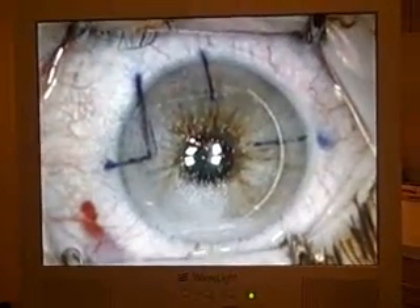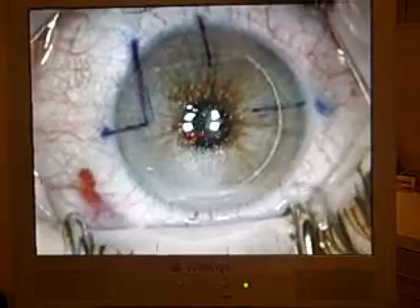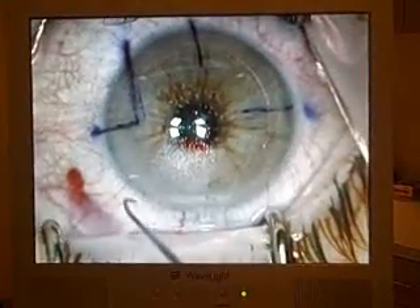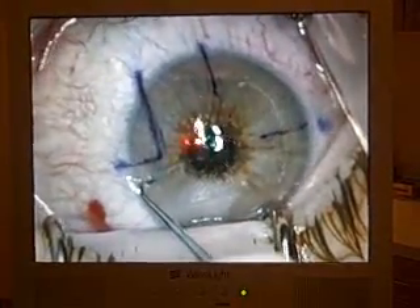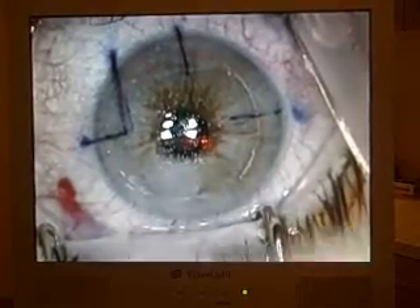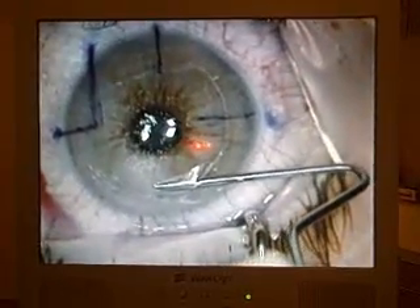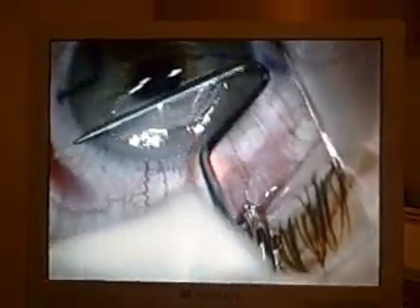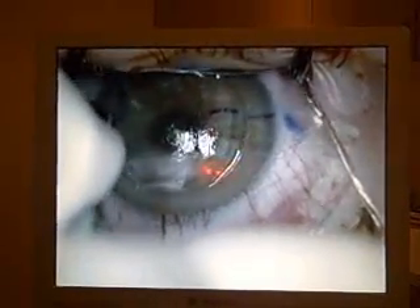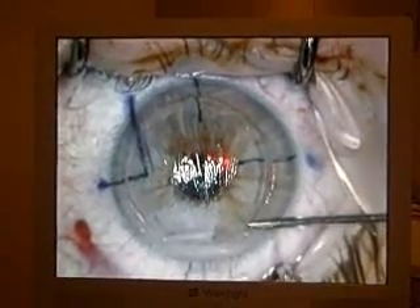We're going to be lifting your flap now, so you'll be aware that your eye is moving a little bit — you've got to keep it moving straight. Find that light again. You almost have a flap up. There you go — that's right at the light. It's going to get a little blurry now because we're lifting the flap.